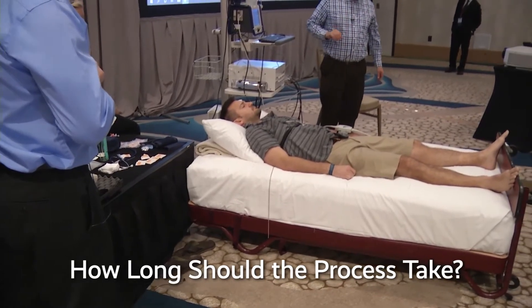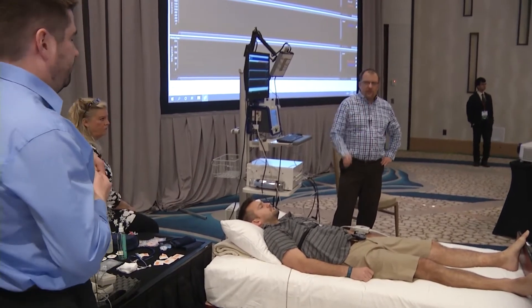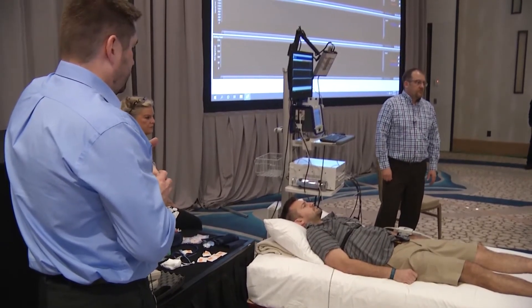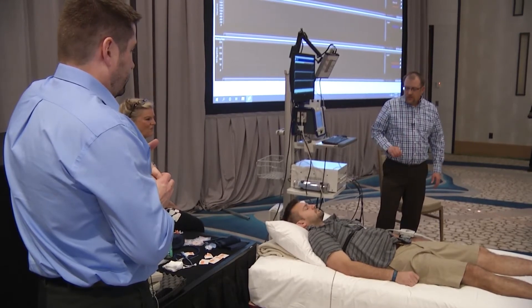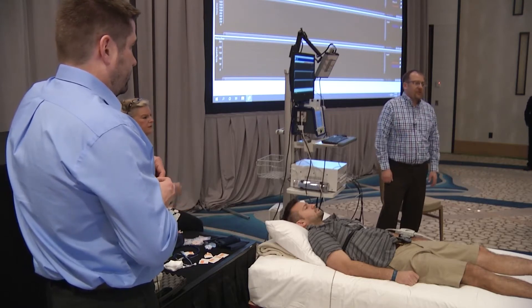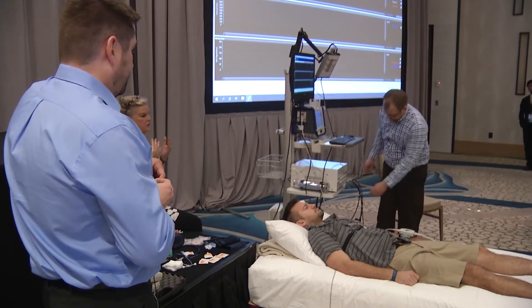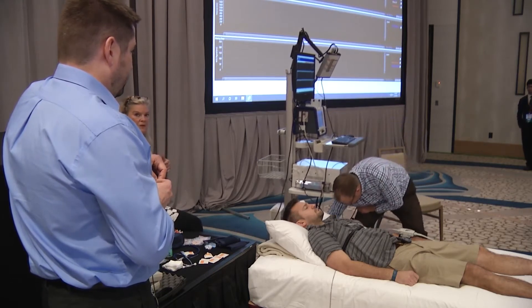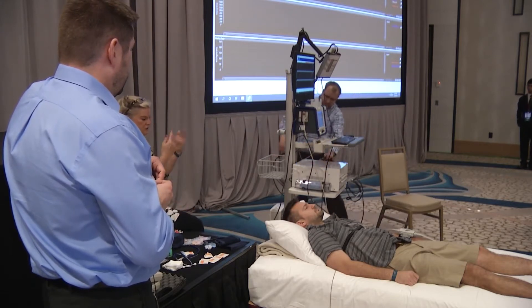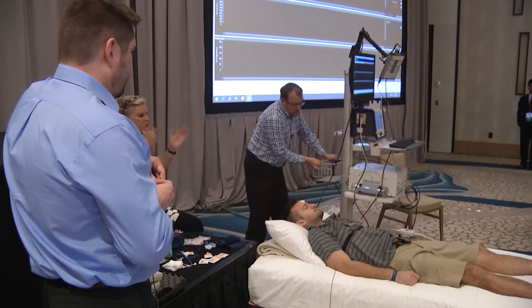For a straightforward patient, door to door, it's about 75 minutes — an hour to 75 minutes. If you have two technicians, that's about an hour. Sometimes if you have the right cooperative patient who's done the test before, you might get done a little faster. It depends on whether you're doing 10-minute baselines in the lab. In research it's often 10 minutes, sometimes five. With a five-minute baseline your total time adds up, but two of us together can do a good test in an hour, hour and ten.